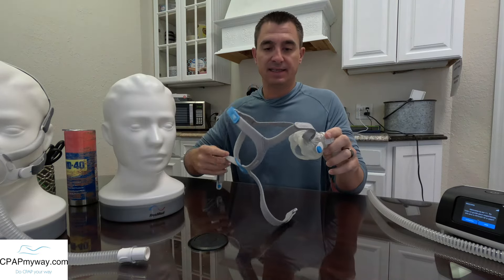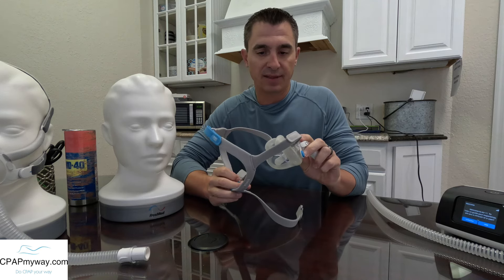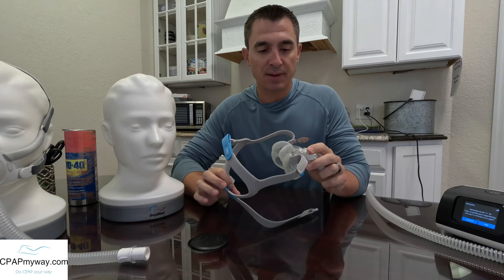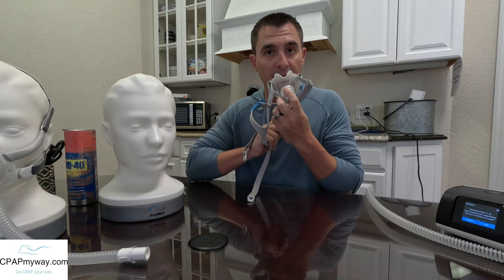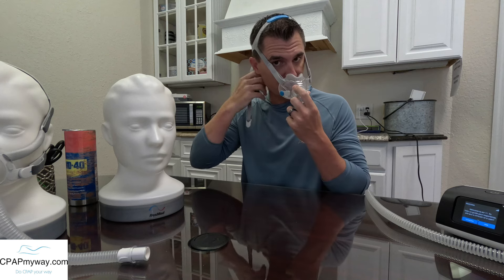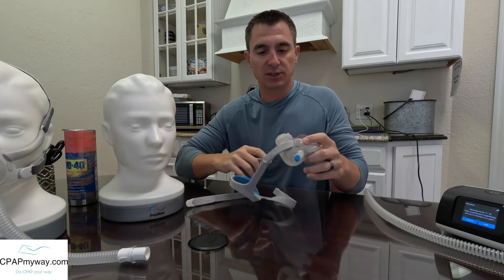Obviously when it comes to fitting this mask, it's going to be very similar between the F30 and the F40. There are a couple of features I want to point out when I get to the frame that makes it a little bit different, but it's both designed to fit under the nose and over the mouth. When you fit it under the nose and over the mouth, you bring your magnets around and lock them out. I'll show you in a little more detail when I try them both on at the end.